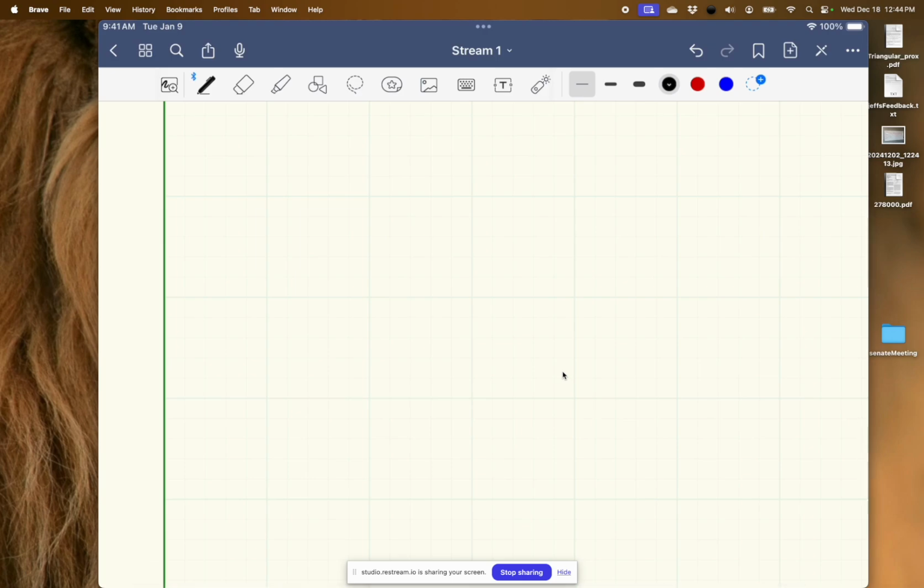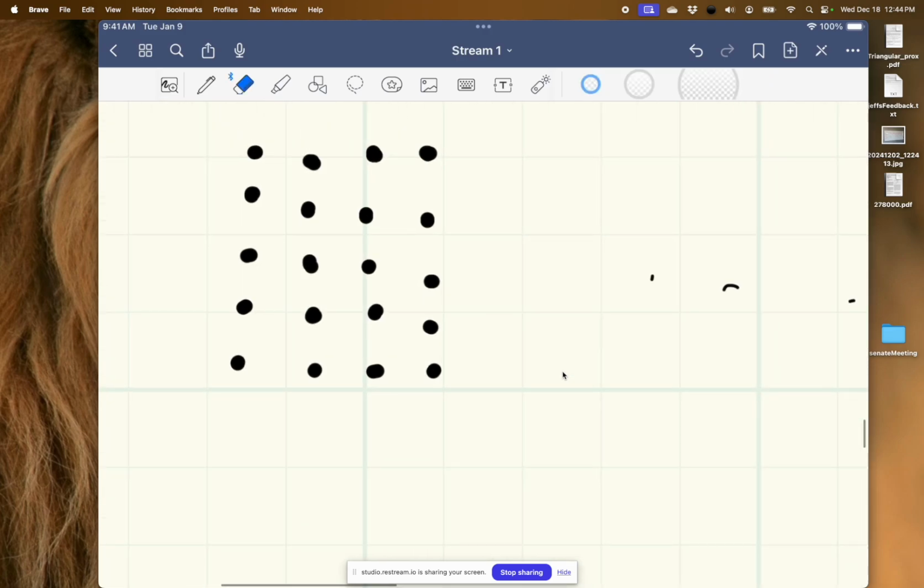And the answer is, this is our k-space again. And again, perhaps I've drawn these as though we collect all of them, but of course, maybe we don't collect an entire row.